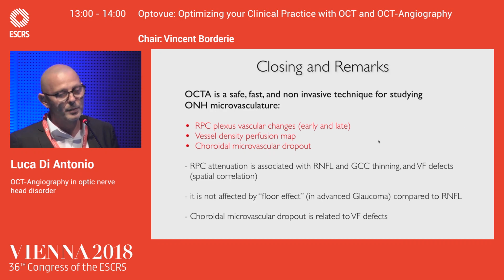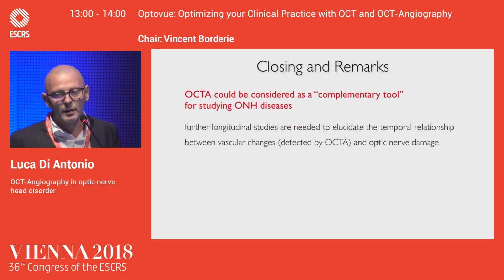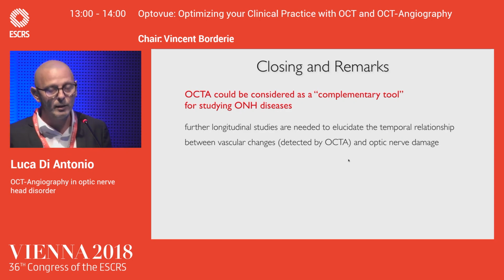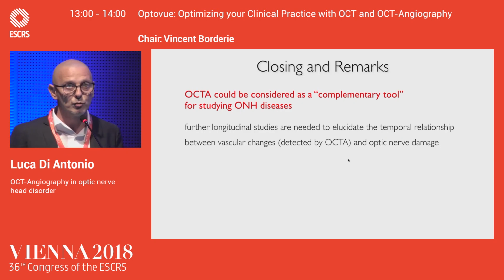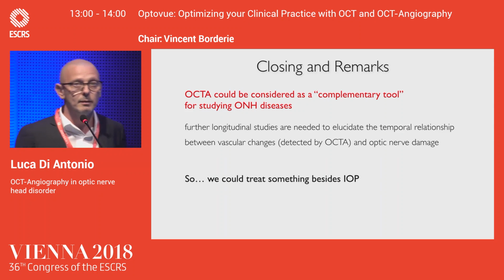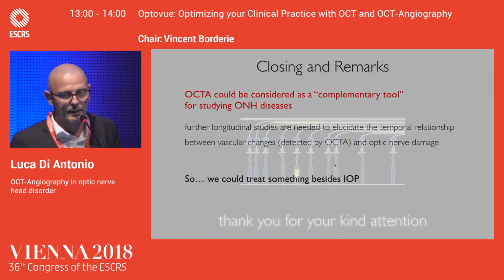And moreover, we can observe that the choroidal microvascular dropout is related to the visual field. So OCTA could be considered as a complementary tool for studying optic nerve head disorders. And further longitudinal studies are needed to elucidate the temporal relationship between the vascular change and the optic nerve damage. So we could treat something beside the IOP. Thank you.